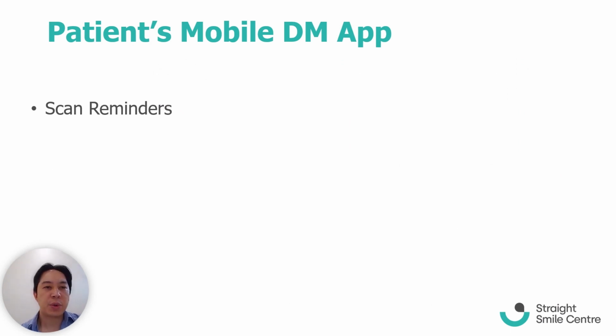Now, from the patient's point of view, they will see scan reminders pop up as a notification on their mobile app. It'll remind them that it is time for them to do a scan. They also get a late reminder as well. So if they forget to scan, they will get another few reminders. These can be set according to your preferences, whether it is multiple reminders or just a single one, that is entirely up to you.